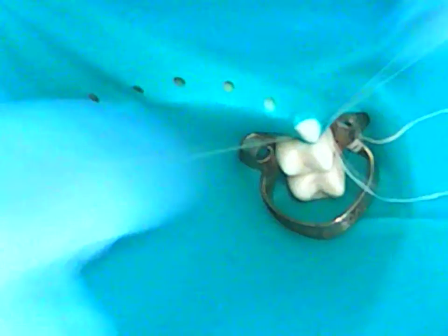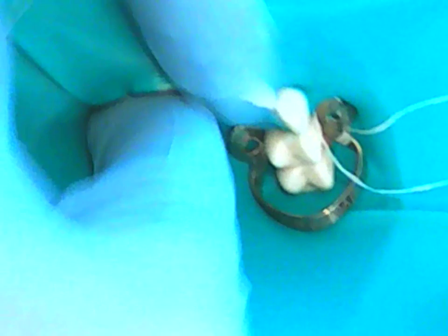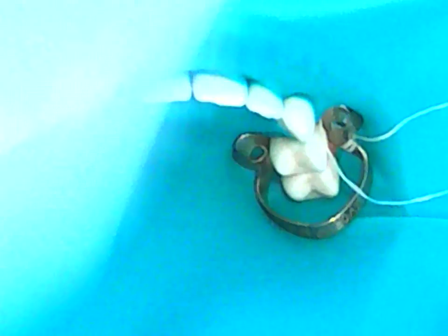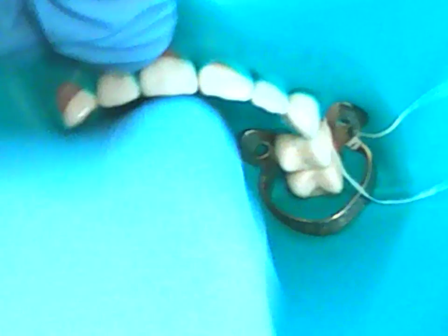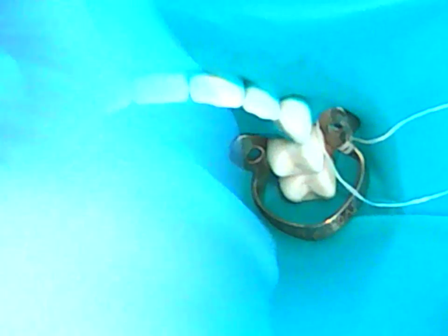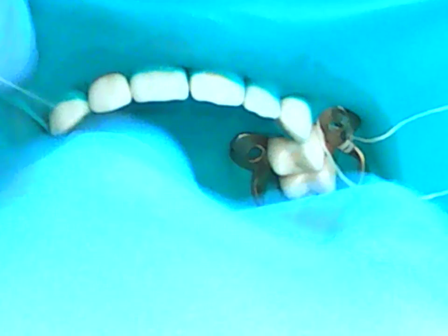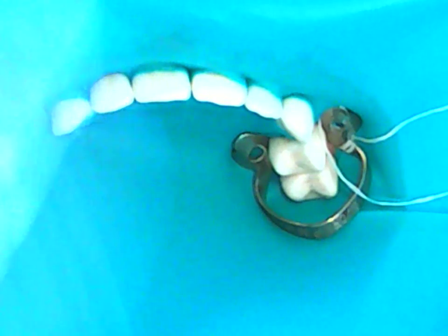I'm going to begin flossing. Like I said, the idea here is just to get the dam through the contacts so that it's staying on for you. And I'm going through the embrasure space. This mannequin has open contacts right there, so I may need to place a couple of ligatures. We'll see how that turns out. That might be okay.